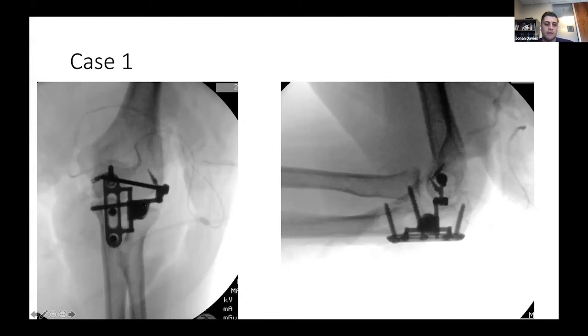And then all of these different hinges tighten, and then I range the elbow and I check stability. And I know we didn't talk about it in the last case, but I always test stability before leaving the OR. So I do full flexion, pronate, supinate, and then full extension, pronate, supinate. And the reason I do both is because sometimes if you have a medial sided injury and you repair the lateral side, then you're hinging around that point. So it's sort of a center of rotation. So I always check all of those.